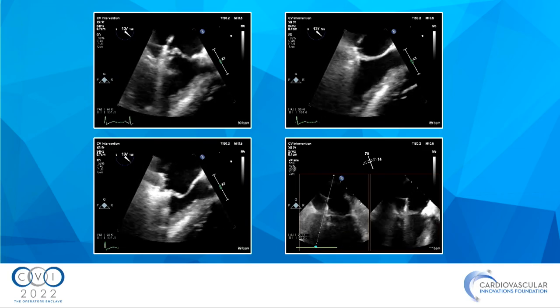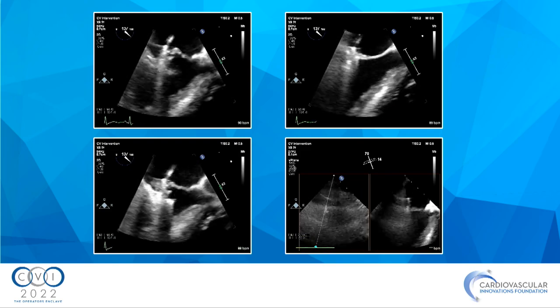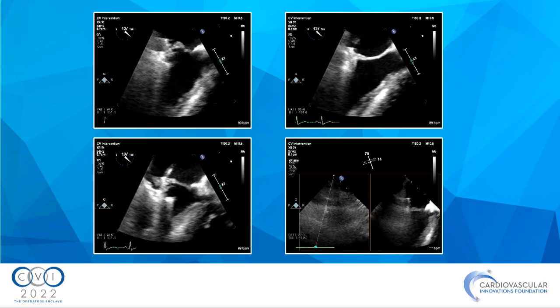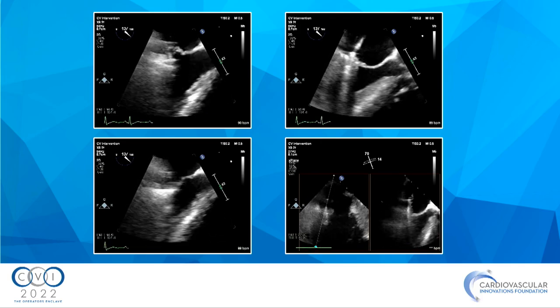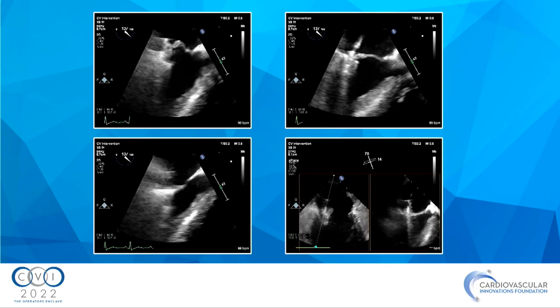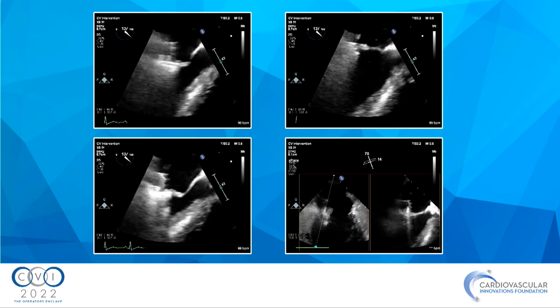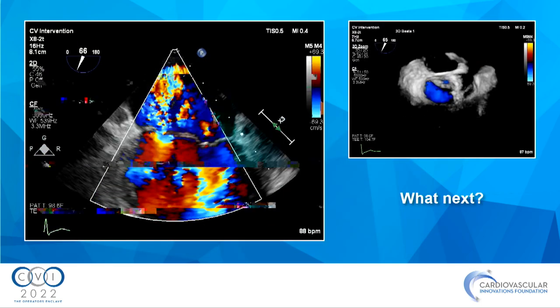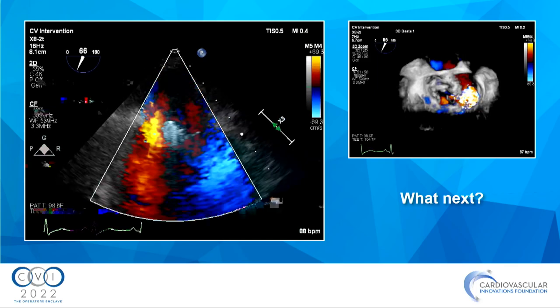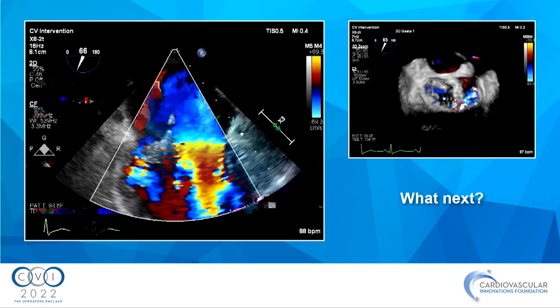So when I've done a few of these now, what I try to do is trap the pap muscle close to where it came from, in other words, on the LV side. But this was so hard that essentially I just took whatever I could get. And so this pap muscle ended up on the LA side. And here's the MR. It just wasn't great. Honestly, it was a bit frustrating.